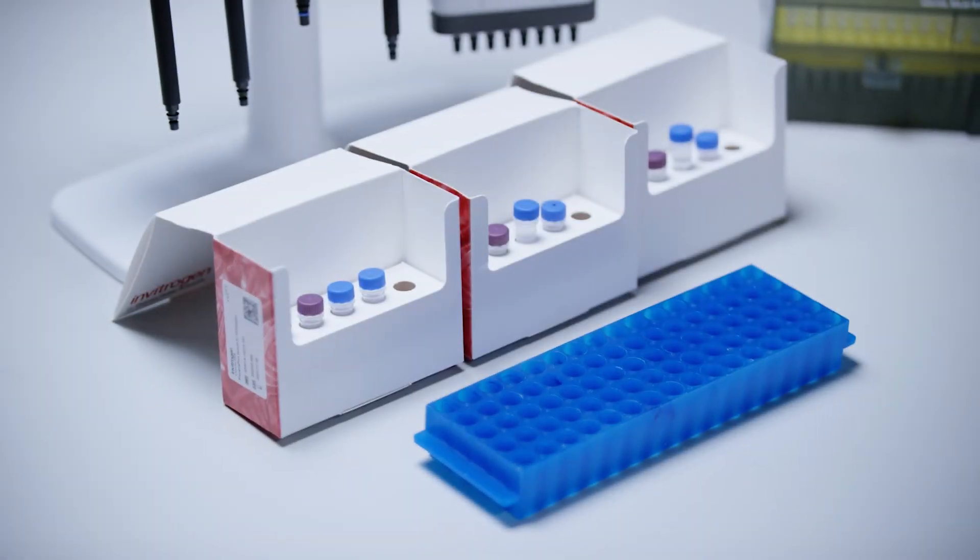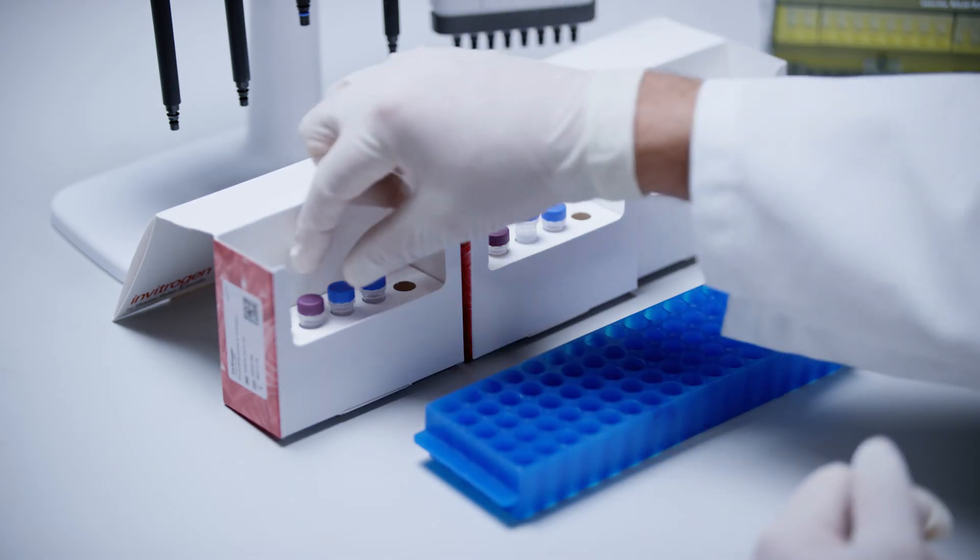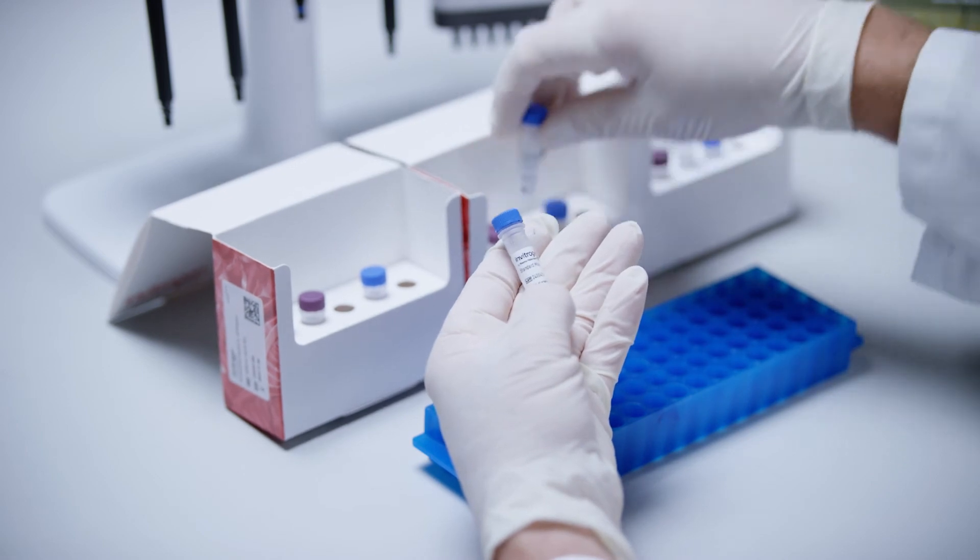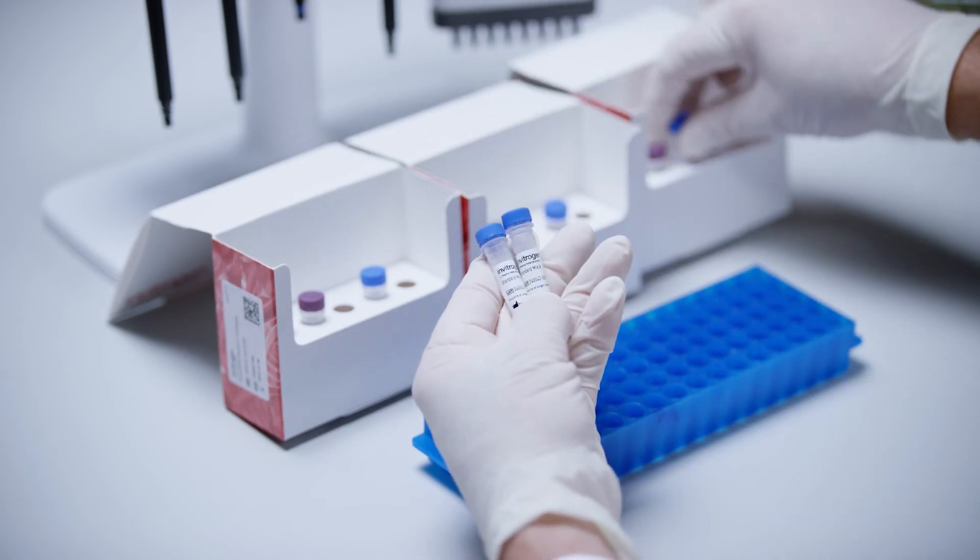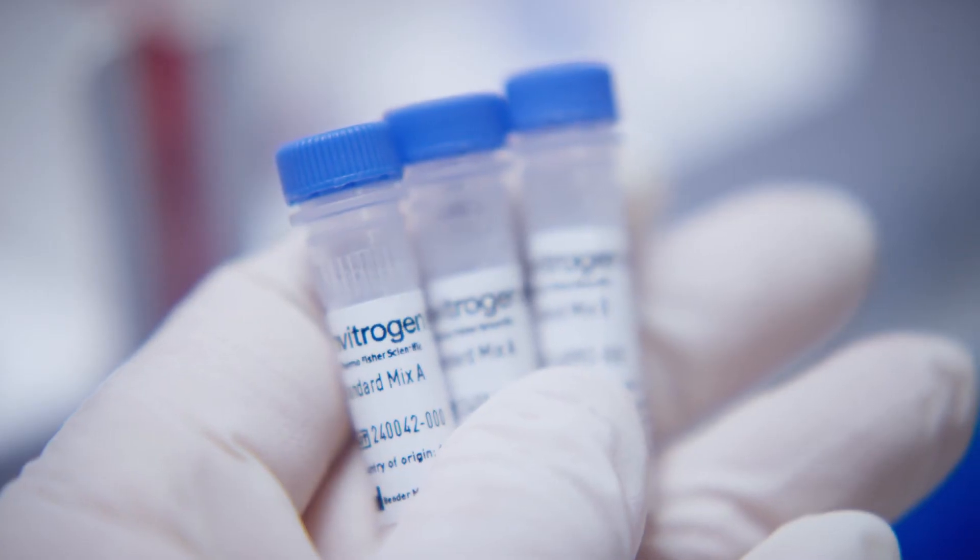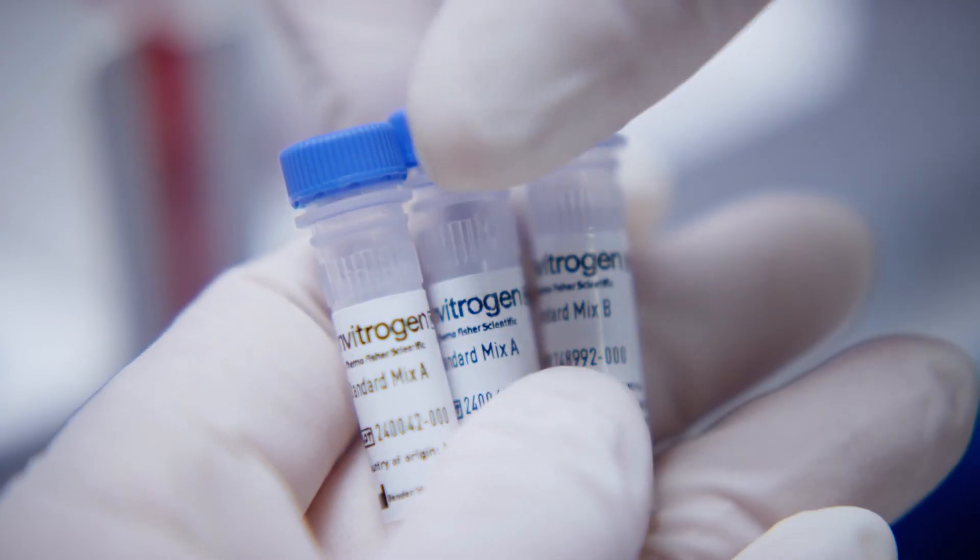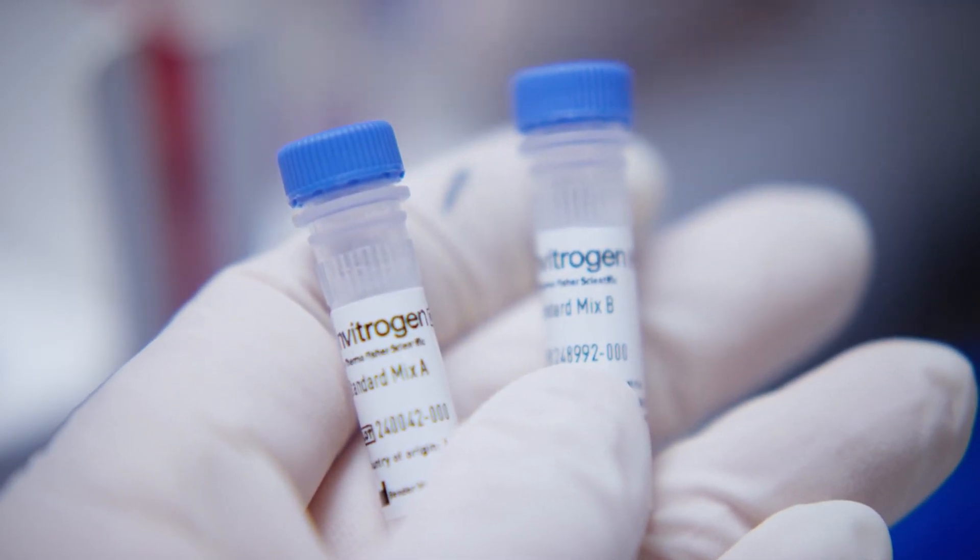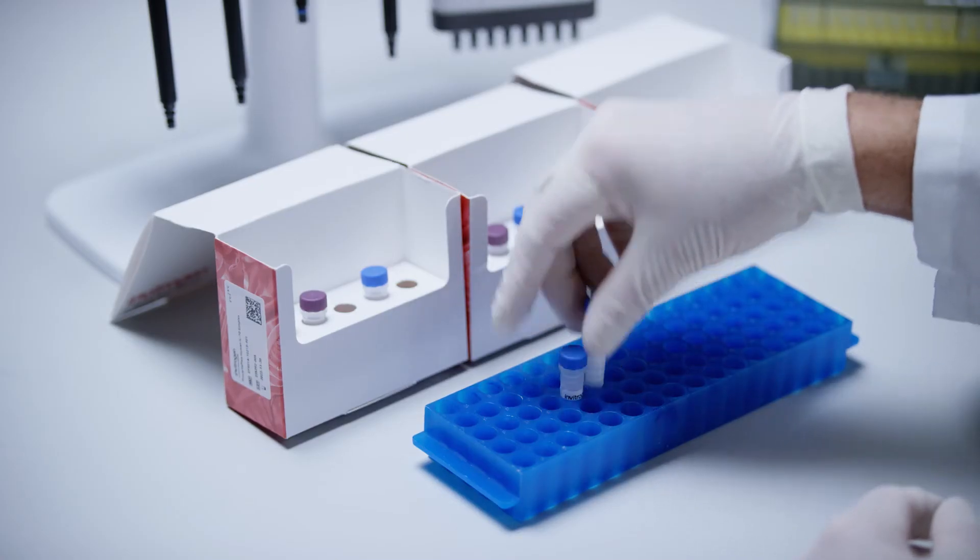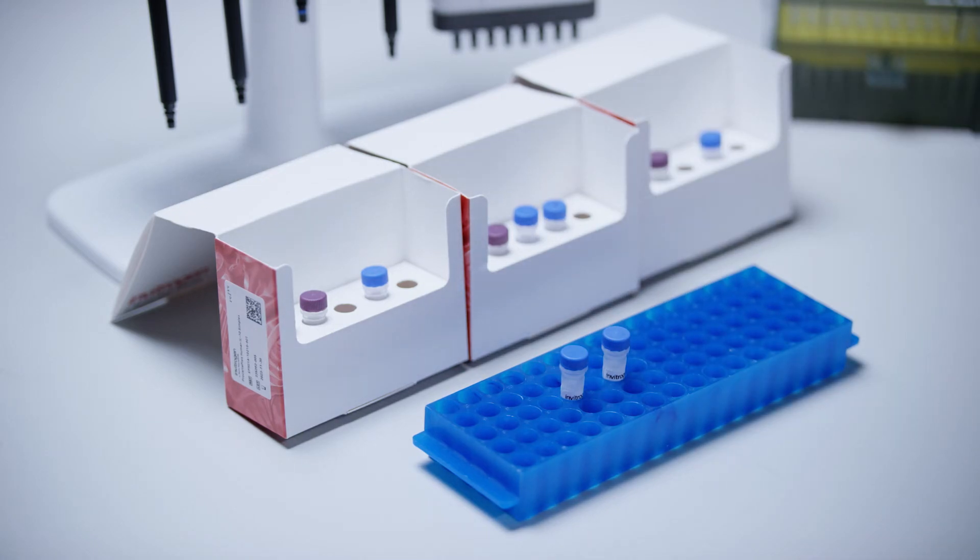In this example, we have three ProCartaPlex simplex kits. Two kits have standard mix A with different lots included and the third has standard mix B. Only one vial of each antigen standard, no matter which lot, is necessary to prepare the complete standard curve. For this run, we need one standard vial from standard mix A and one standard vial of standard mix B. All the other vials will not be needed for this run and can be stored for further use. You can use whichever lot you want. Write the lot of the used standards down as you'll need it for calculating the results.